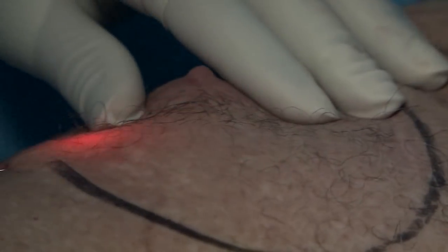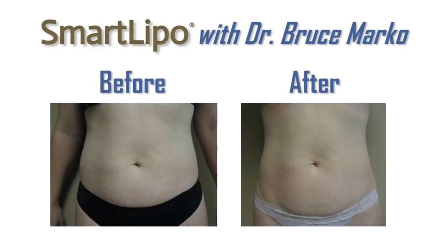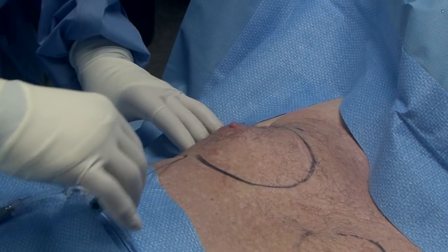That helps us prevent getting any burns or introducing too much energy into a small area. This helps melt the fat. It'll also do a little bit of skin tightening and helps lay down some collagen after a couple of months. So it's a great device. We'll show you later — we'll do a little bit of suctioning on top of this.